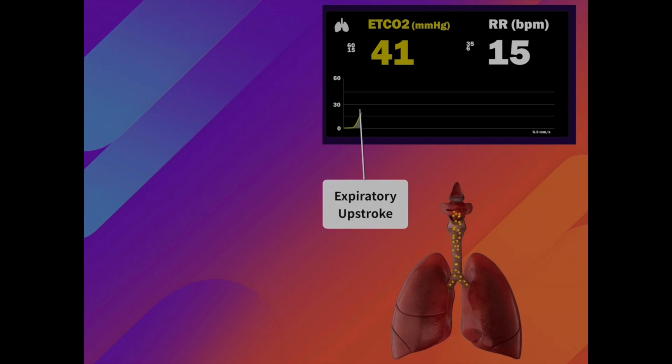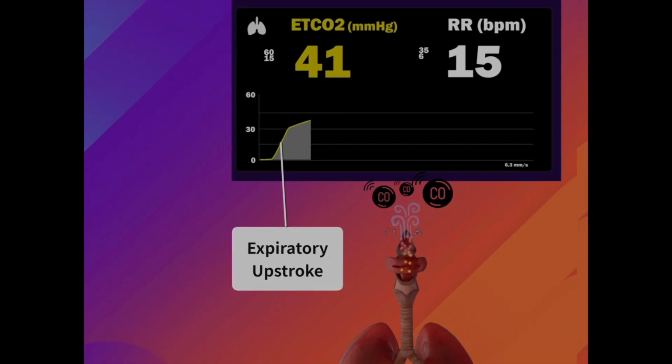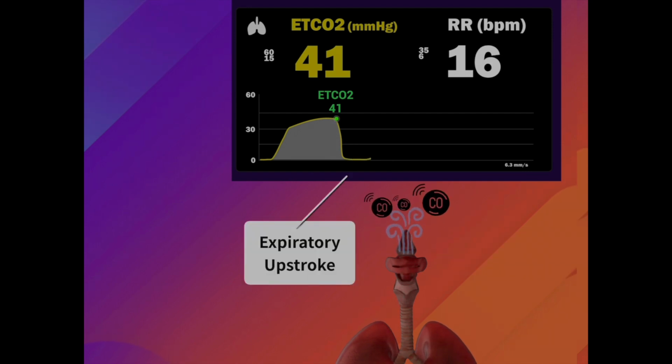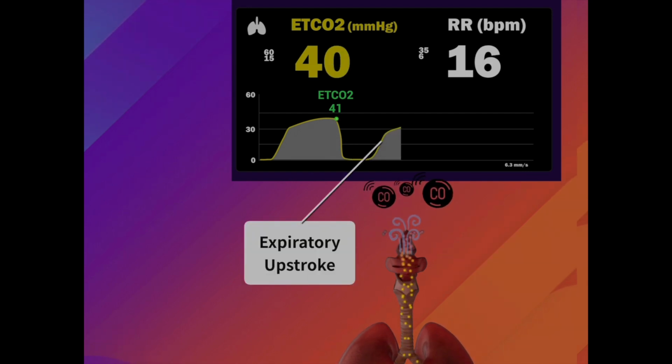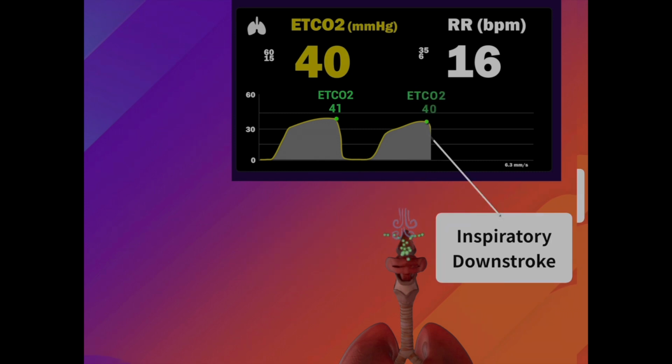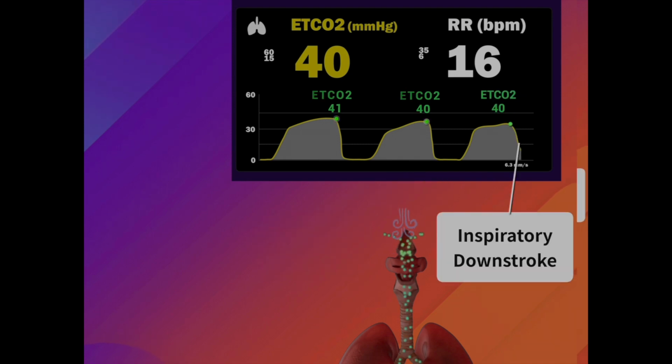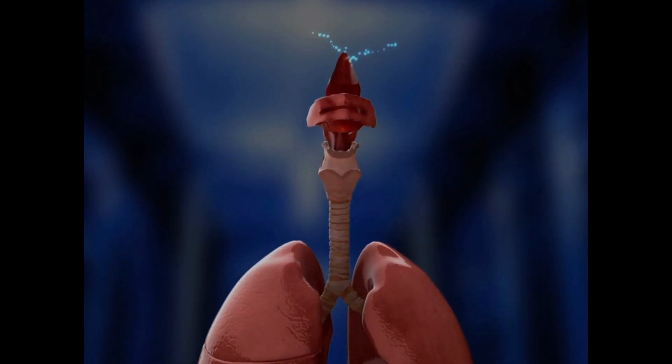Capnography assesses a patient's real-time ventilation, with ventilation referring to the amount of air that enters and leaves the alveoli. With every breath of atmospheric air, or the combination of gases, which include oxygen, a person takes in, their lungs will exchange gases between the inhaled breath and those that are being channeled through the lungs.